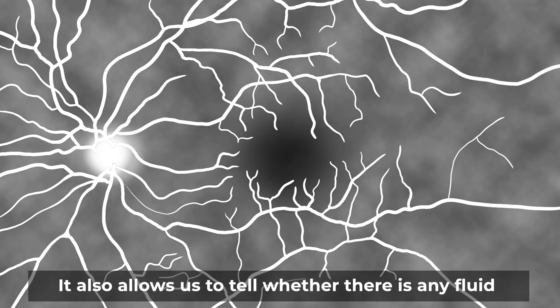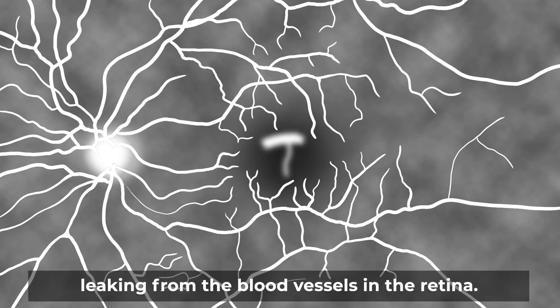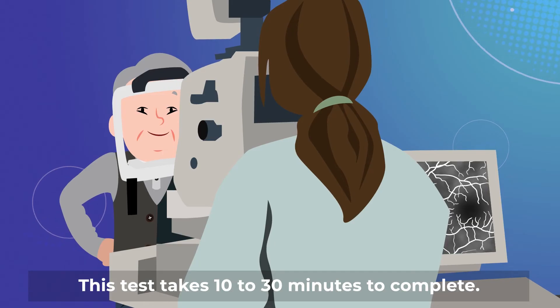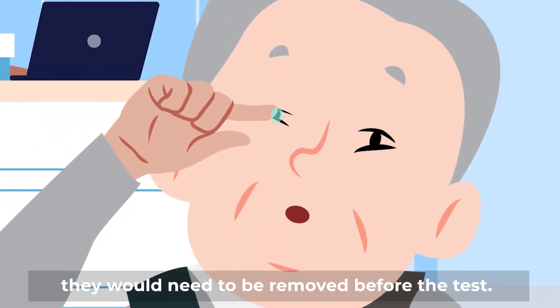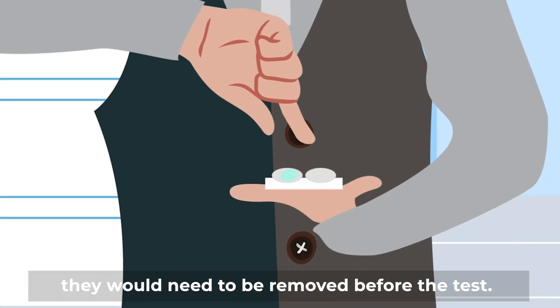It also allows us to tell whether there is any fluid leaking from the blood vessels in the retina. This test takes 10 to 30 minutes to complete. If you wear contact lenses, they would need to be removed before the test.